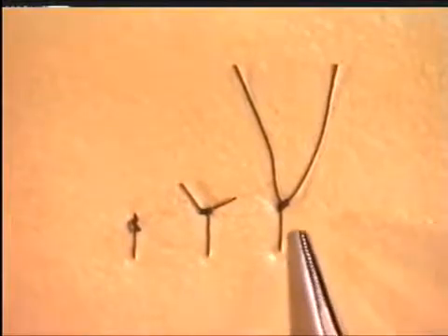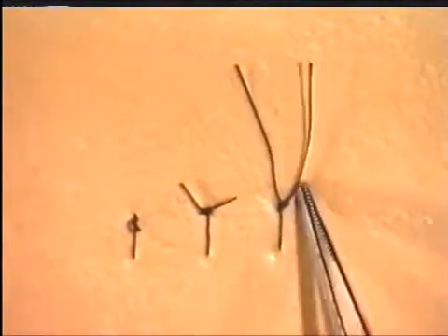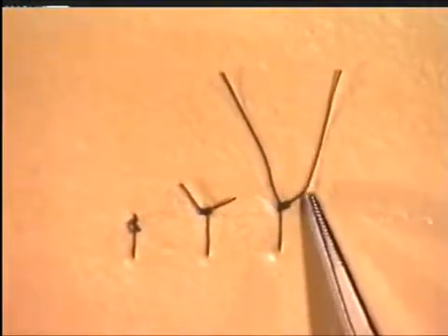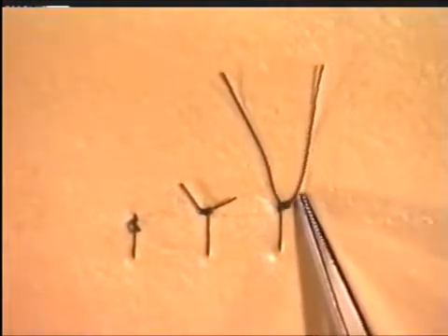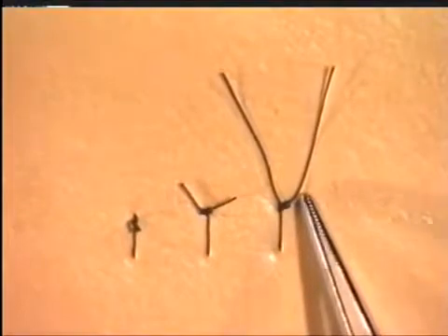When cutting sutures, do not cut them too long, as this long length of thread will be a needless waste of suture material and will get caught up in the wound or in the dressings.